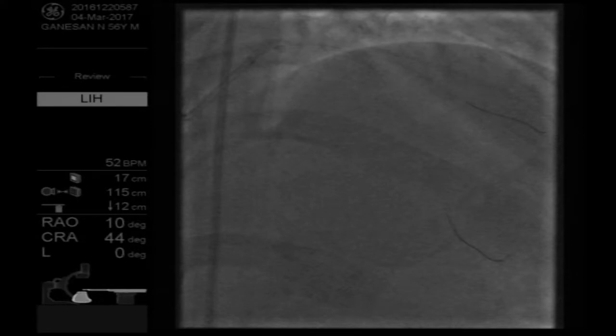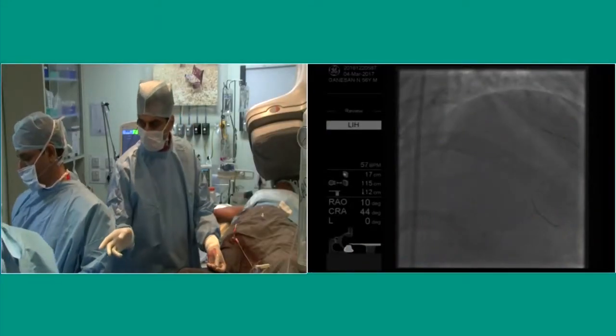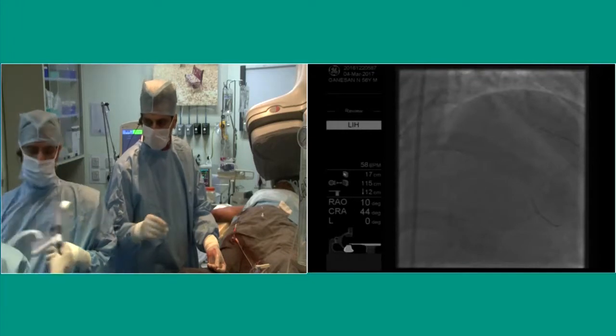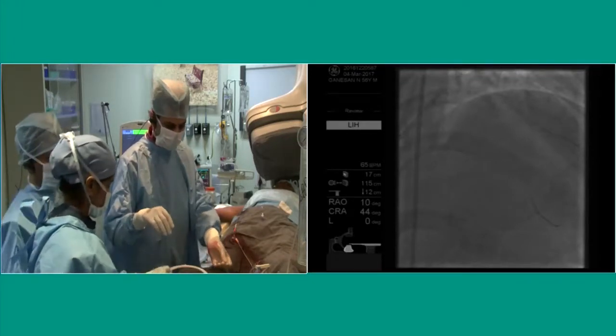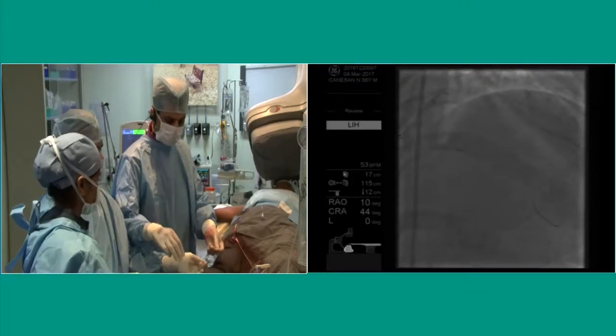As we are preparing the cutting balloon, I want a panel suggestion on the type of stent. Do you still agree with any regular stent, or do you want a stent which can go up more? Colleagues, any suggestion for a specific stent that would allow post-dilatation to increase its size way above nominal?